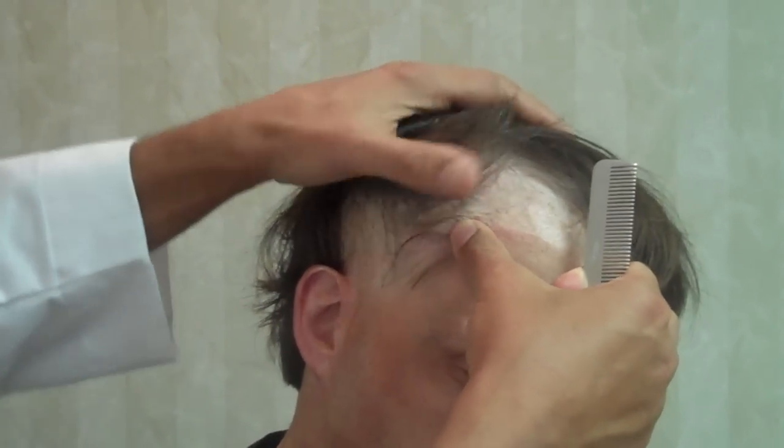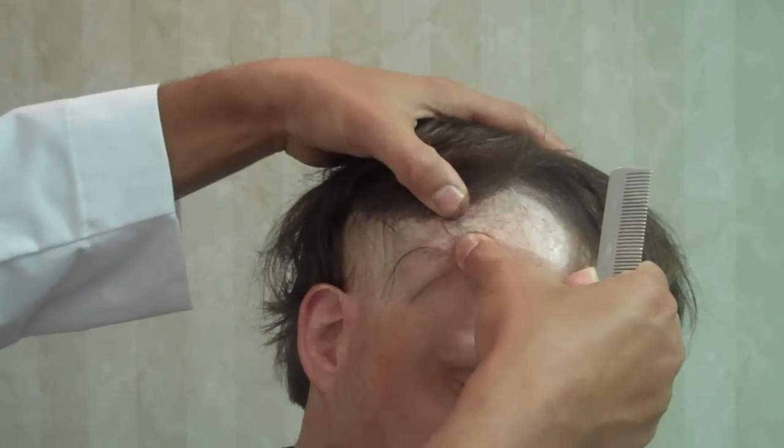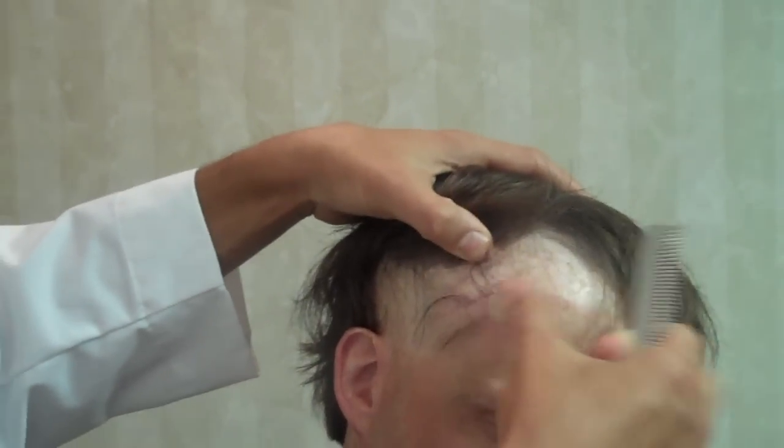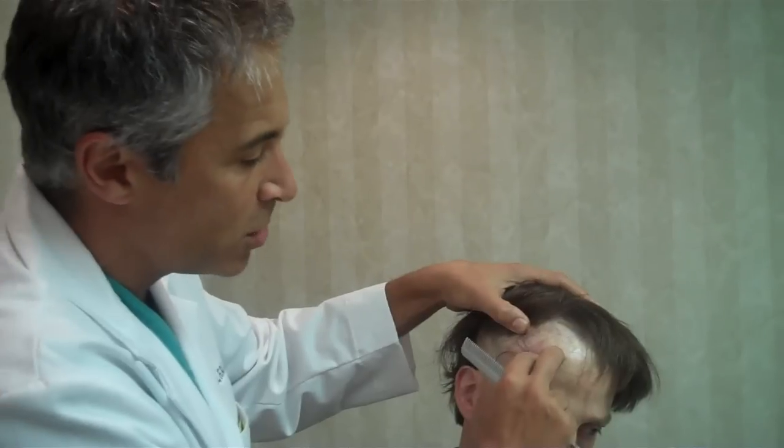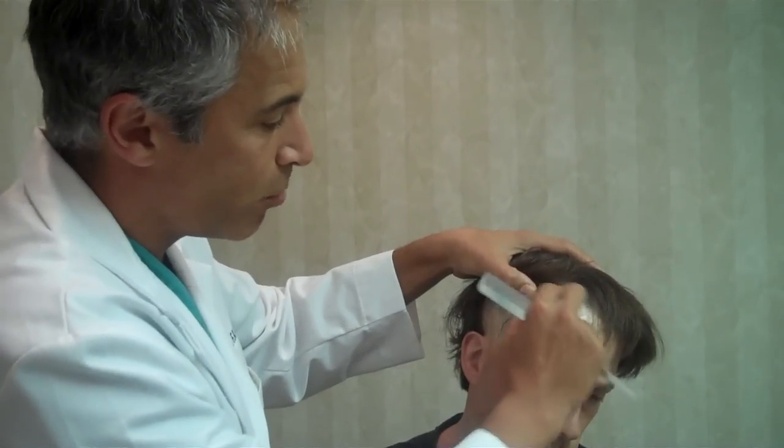We have a couple of options. I am going to try to excise some of this today, and at some point, if we still need to, we can always put a small balloon expander in, but I don't anticipate we're going to want to do that. We're going to try it without that and see if we can just serially excise it. As soon as 3-4 months later, once everything is healed up, we can then bring him back and do some hair grafting into what will now be much more normal, non-scarred scalp.